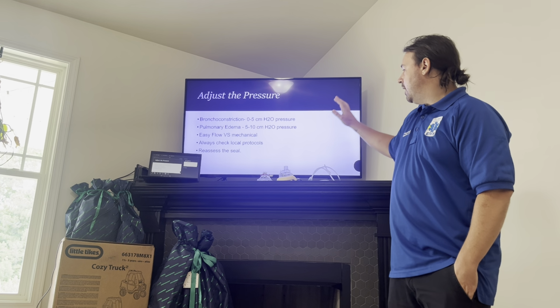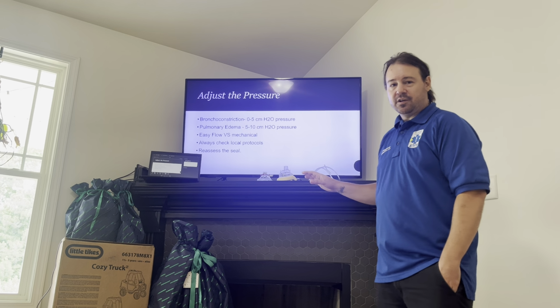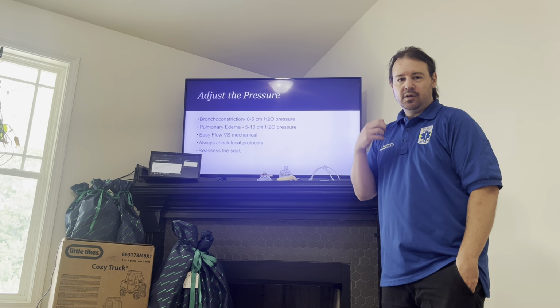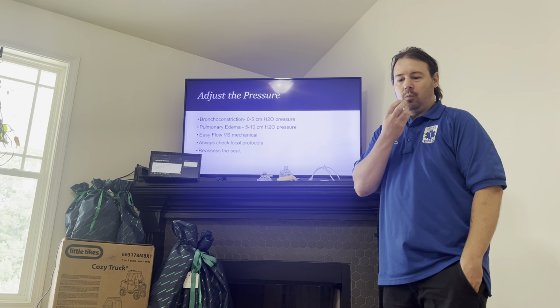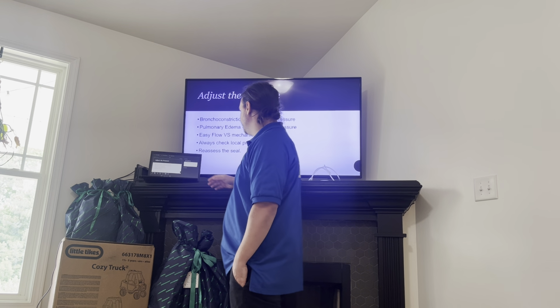But then, as always, we will reassess the seal after we adjust the pressure, because when you add pressure, if the mask is too loose, you will start to get more leaks in the seal as you increase the pressure.